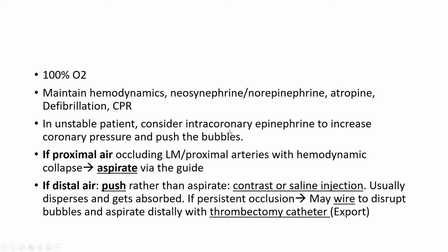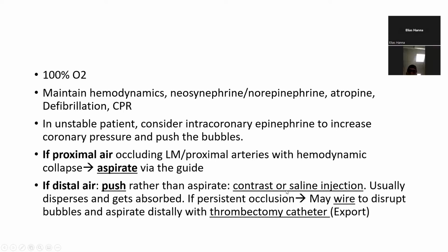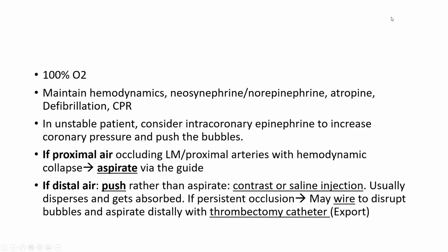In an unstable patient, you can even give intracoronary epinephrine to increase arterial and coronary pressure and push the bubbles. Sometimes CPR, hopefully they don't reach that stage, but if they do, CPR can disrupt the bubbles. Now, if proximal air is occluding the left main or proximal arteries with hemodynamic collapse, aspirate via the guide, even your diagnostic guide. If distal air, you can push rather than aspirate, with contrast or saline injection. Usually the push technique will disperse the bubble and make it get absorbed.